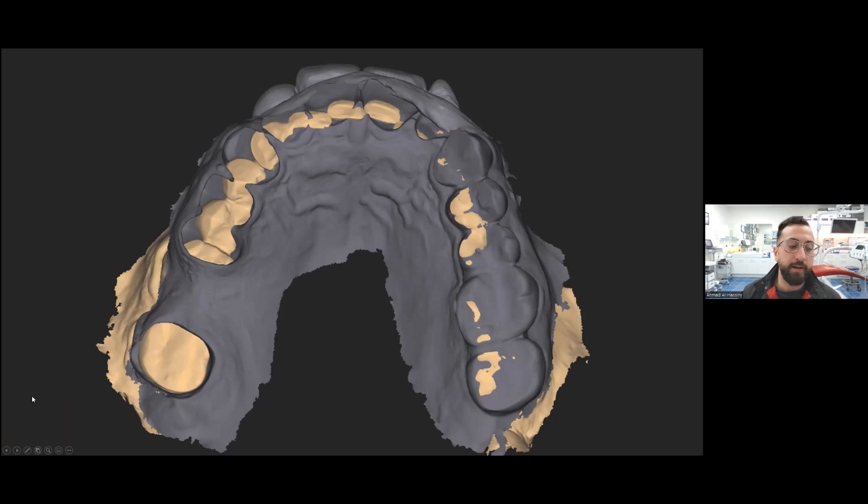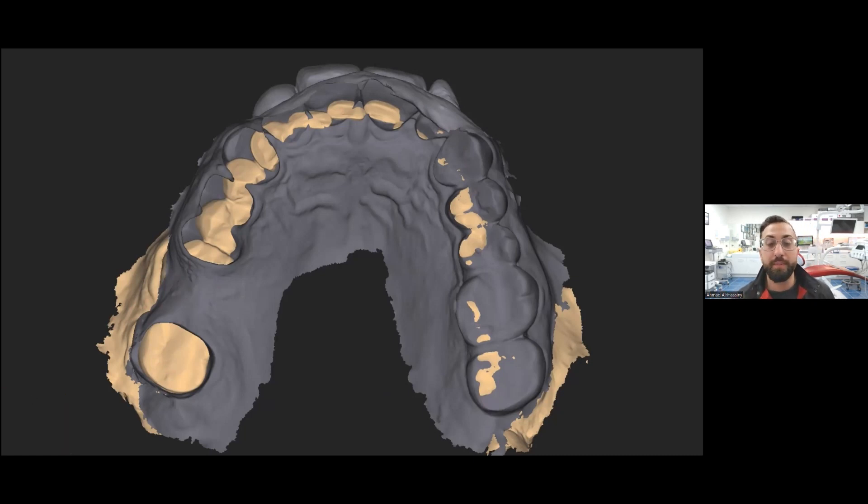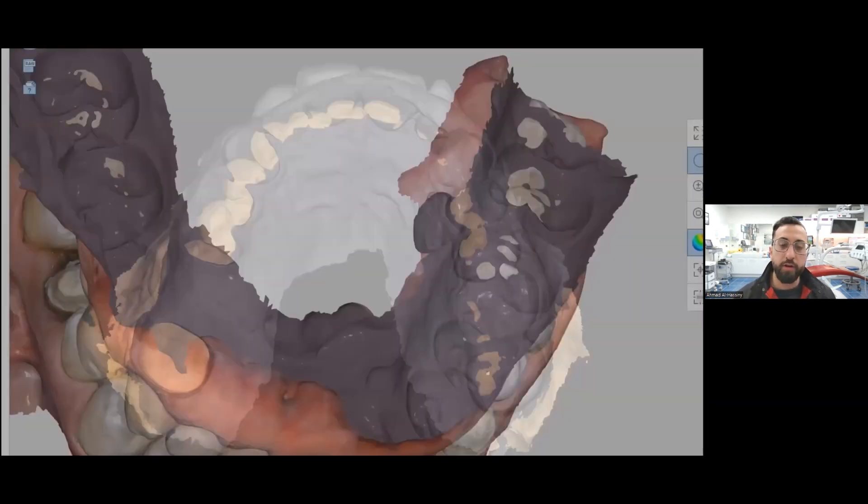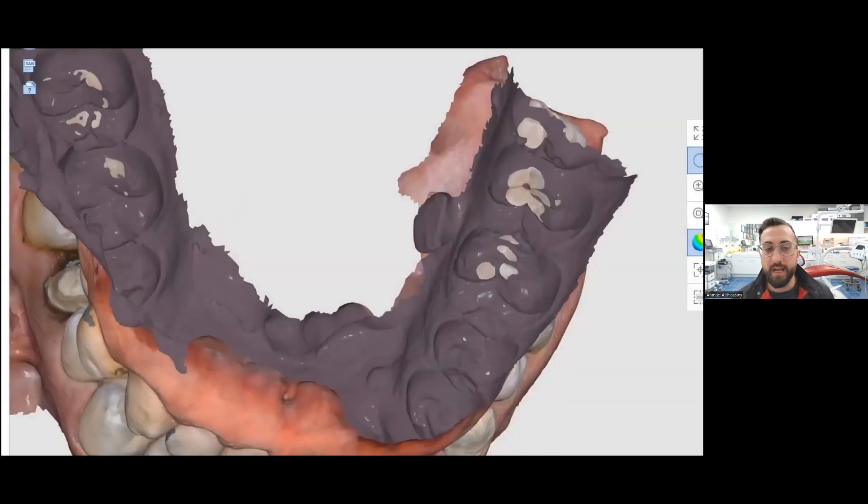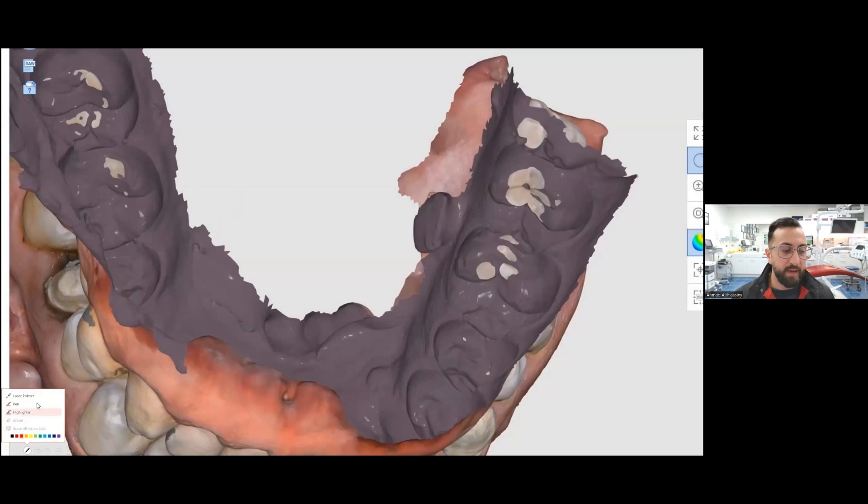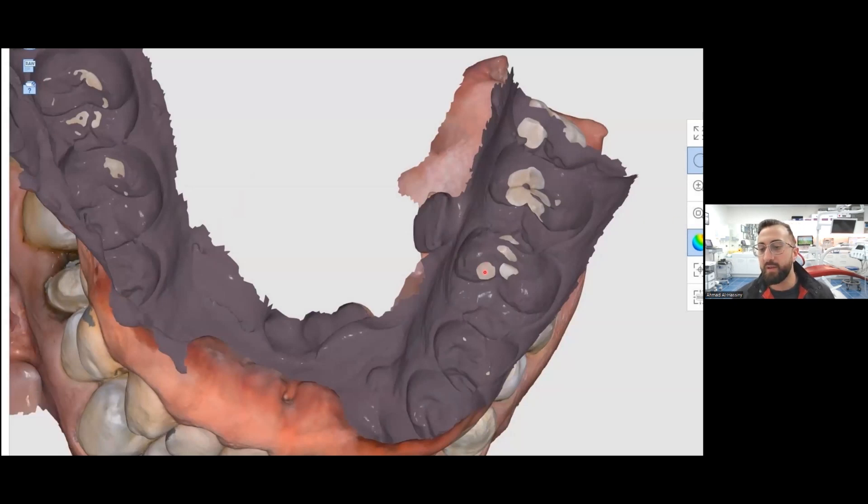This is a really frustrating thing with intraoral scanners, because I don't think many people understand why this happens. And there's a lot of theories. Here's another example, a little bit more of a color example. You can see we're doing this crown down here, we take a bite scan, and then we see all these intersections over here.